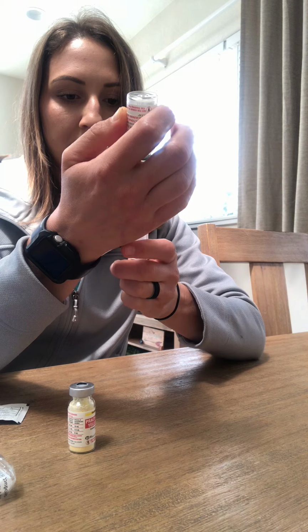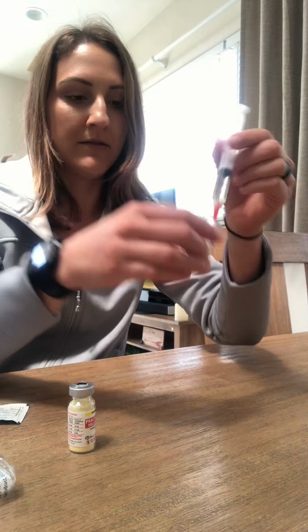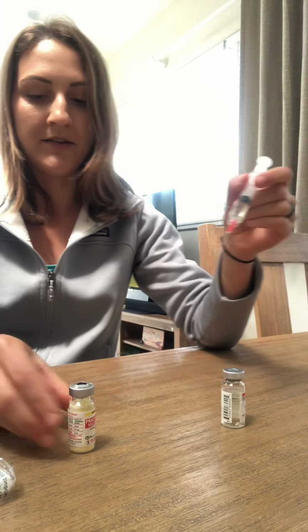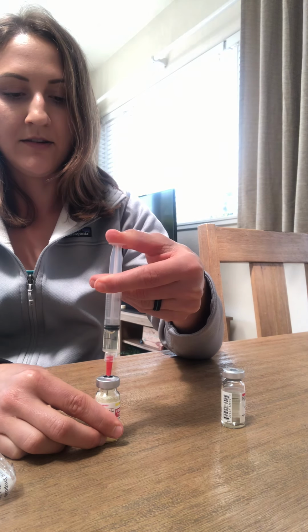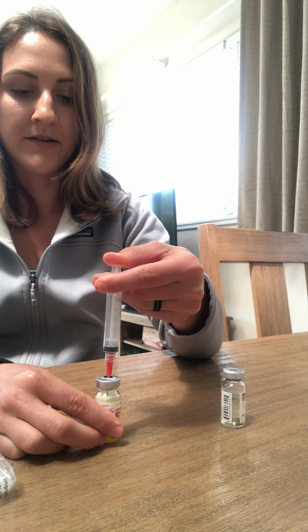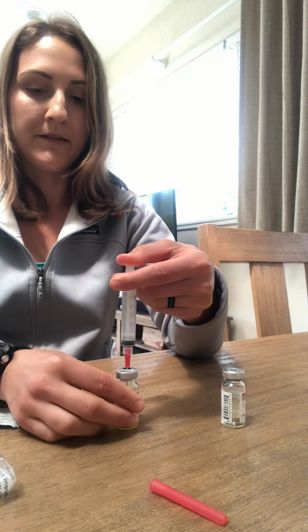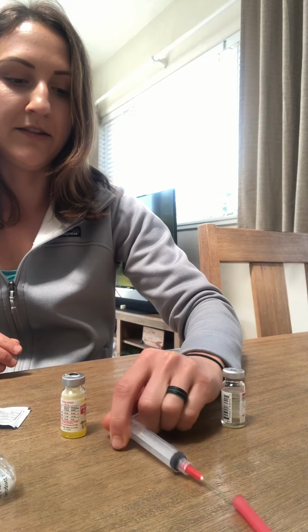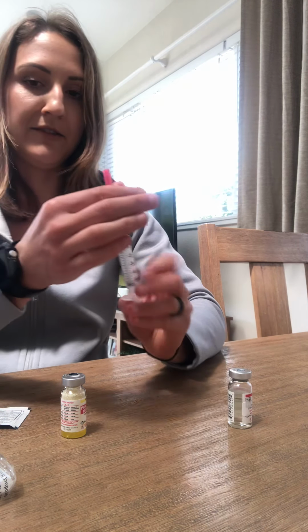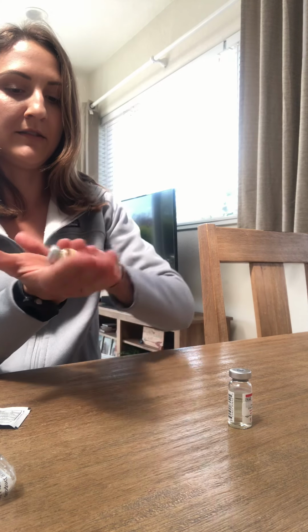Okay, expel any air bubbles. Confirm that I have the right amount. Reinvert. And then inject the diluent into the powder. Take out my needle. Recap with the one-handed technique, maintaining sterility. And then I'm going to reconstitute my medication.